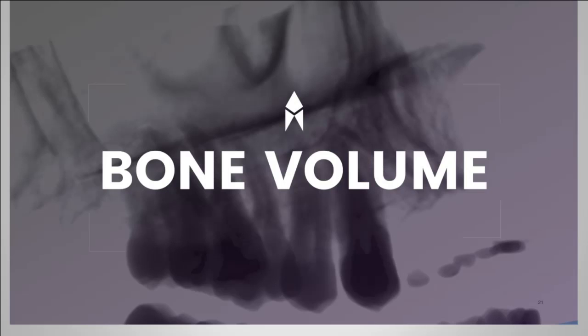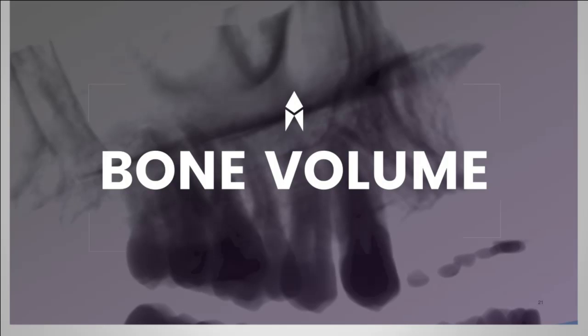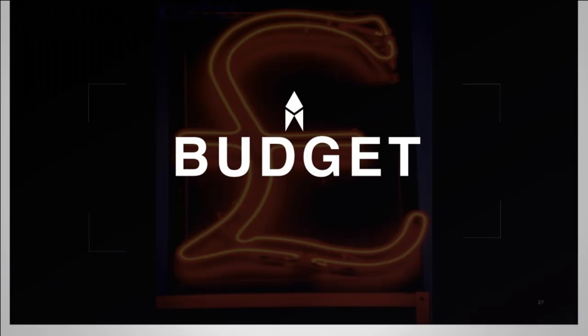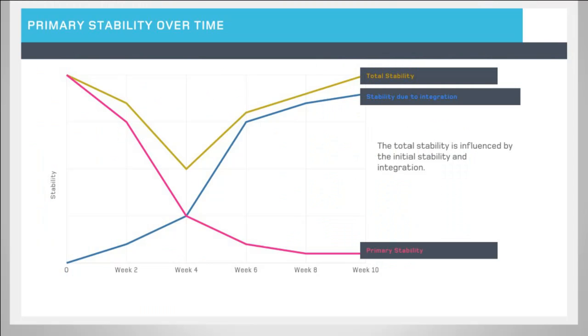So with this variety of different options, what will you look at when assessing your patient to see which option is suitable? We're going to look at bone volume, the biomechanics, and the budget, meaning how much these different options cost your patients. We can't talk about full arches without discussing immediate placement.